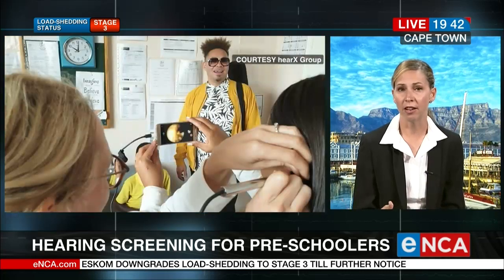And I suppose, Tersia, many people out there this evening wondering, just how important is it for us to be able to have a device like this? I mean, we often don't consider that a child might not be hearing well, and that leads to all other kinds of diagnoses about what could possibly be wrong with them. You're absolutely right. So, for instance, in Africa, we have 1 hearing health provider for every 1 million people. So you can just imagine the need out there, and yet ear disease is one of the most common diseases that young children experience. Like every young child under the age of 3 would most probably once experience at least a middle ear infection, for instance.